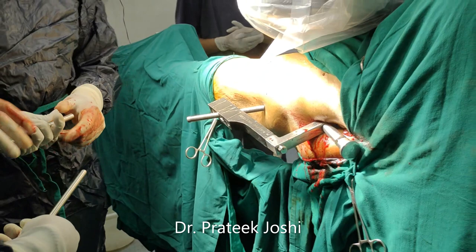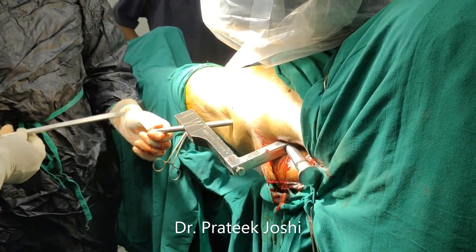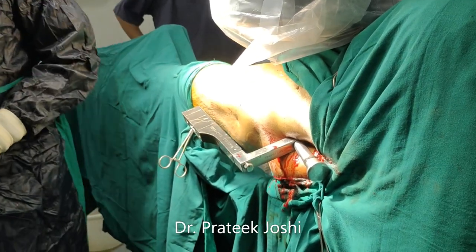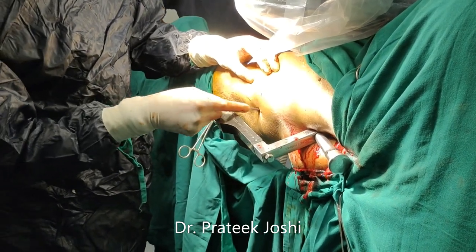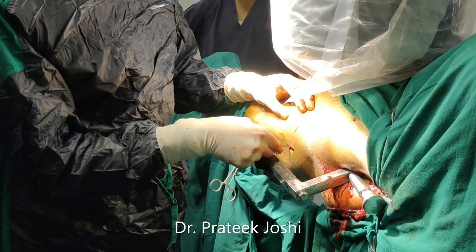Now we advance two guide wires through the jig for the proximal screws of the PFN. The position of the guide wire should be confirmed on the IITV in such a way that they are in the center in lateral view, and in AP view the inferior guide wire should be touching the calcar and going towards the center of the head.